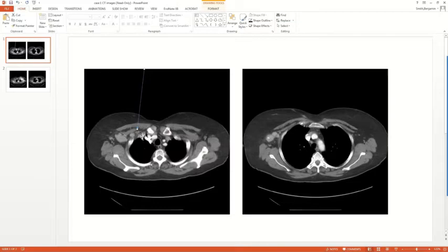This is so important to know about as a radiation oncologist because very few surgeons are actually going to dissect this space. And even if they do, I don't think you can really rely on surgery alone to remove a malignant lymph node like this. And so we always give these patients a boost to the infraclavicular region.